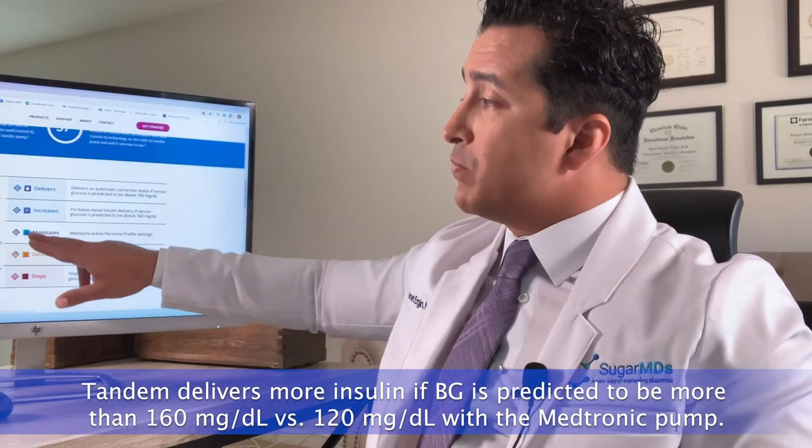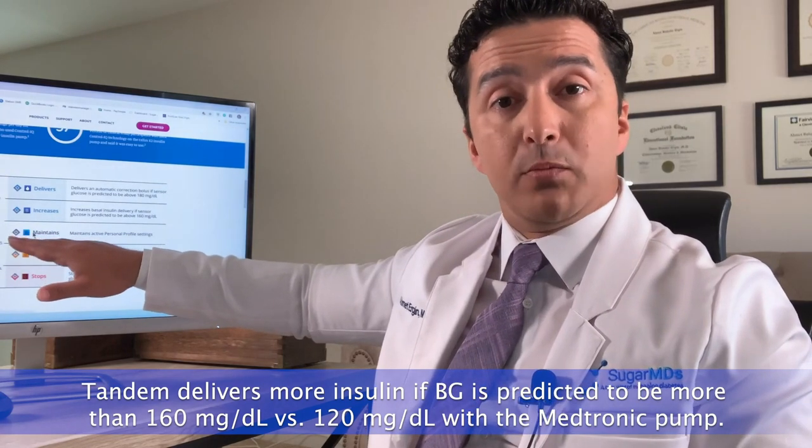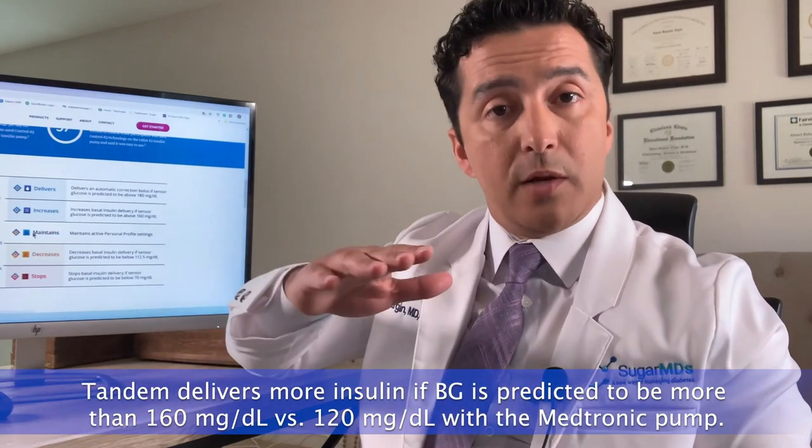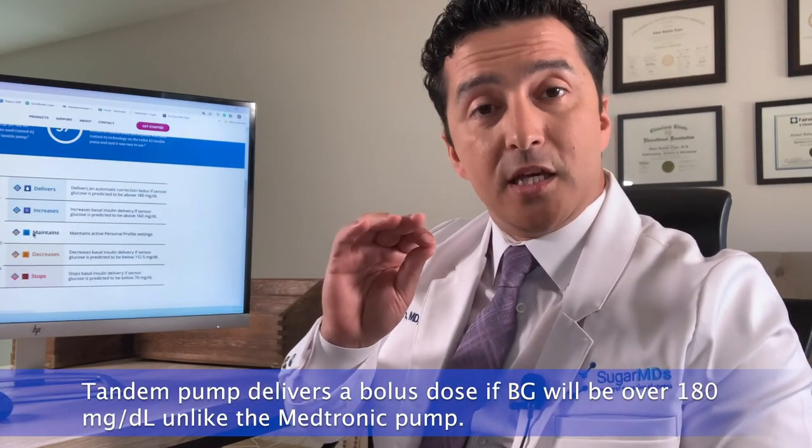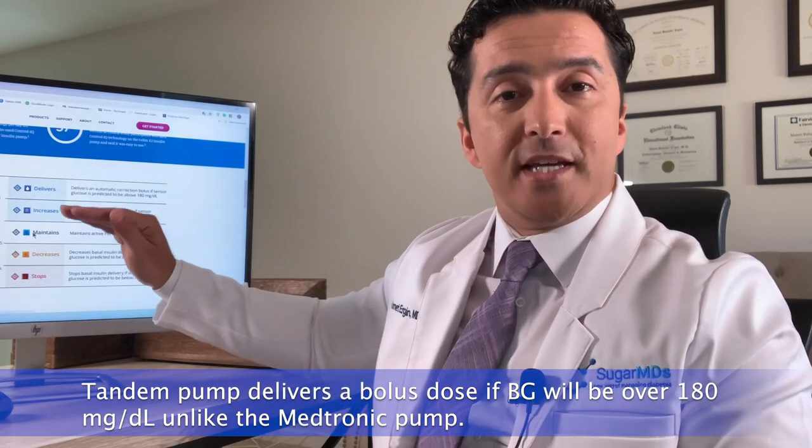Tandem will deliver more insulin if it predicts blood sugar will exceed 160 mg/dL, versus Medtronic which increases insulin when blood sugar is predicted above 120 mg/dL. So Medtronic tries to keep you in a narrower range around 120. With Tandem, unless your predicted blood sugar exceeds 160, you will not get additional insulin — but importantly, if your predicted blood sugar exceeds 180, Tandem will actually deliver an automatic correction bolus, which Medtronic does not do.